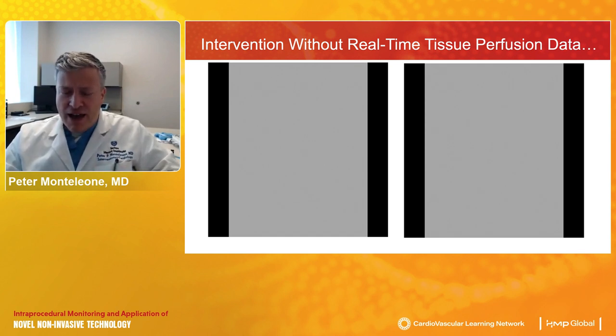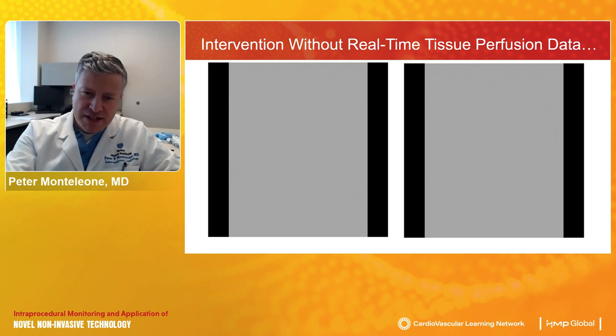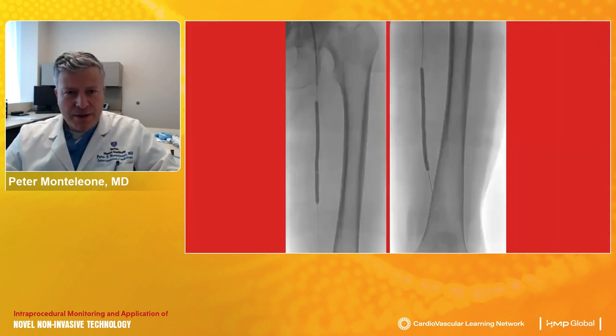This was a case in an individual who, similar to one of the cases we saw earlier, had multiple different anatomic lesions in the setting of presentation with really severe rest pain in the lower leg. We see here diffuse proximal and mid-vessel superficial femoral artery disease. We also see, lower right at the adductor canal level, a complete total occlusion of the distal SFA entering into the popliteal artery. Fairly obvious by angiographic information alone to proceed with revascularization at these two levels.